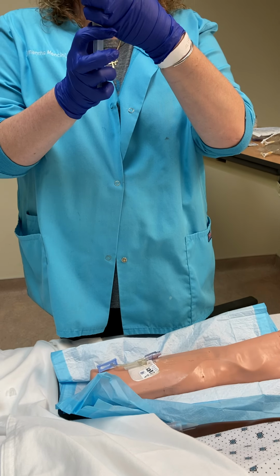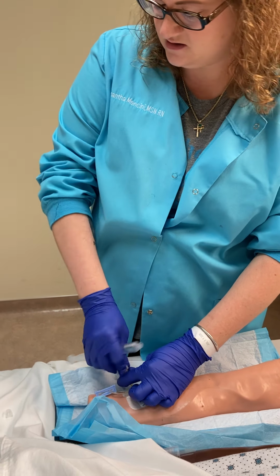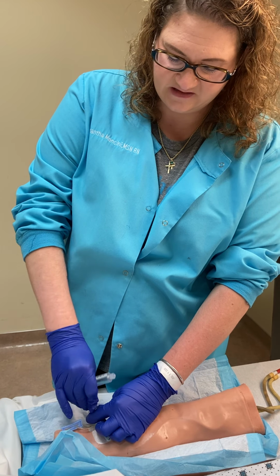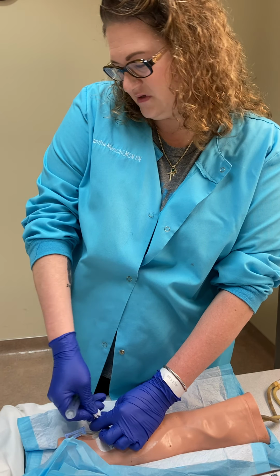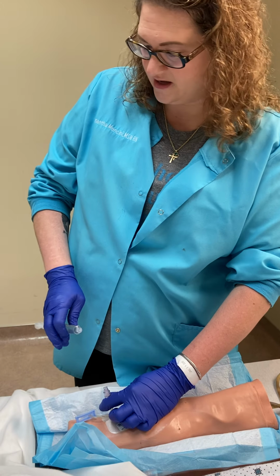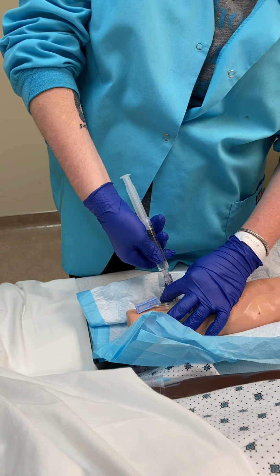You always want to make sure you get your bubbles out. No air bubbles being given to the patient. We want to scrub the hub for 15 seconds, so you need to say your ABCs twice or happy birthday. The 15 seconds is absolutely necessary. Okay, so we did a 15-second scrub. We allow it to dry, and then this just screws on here.